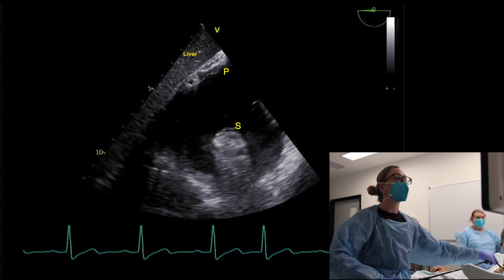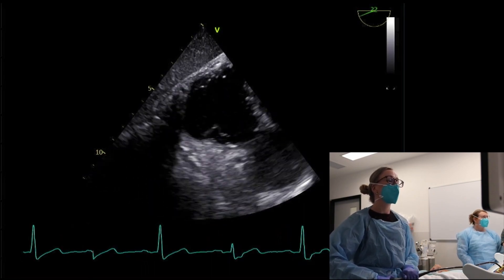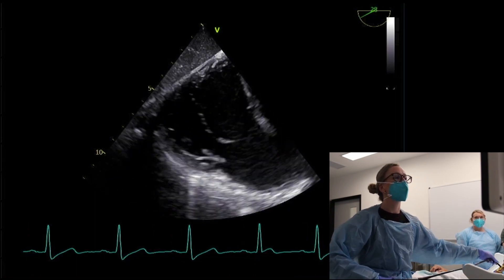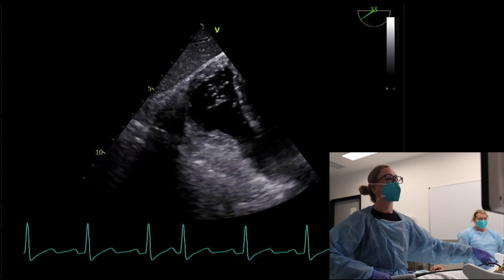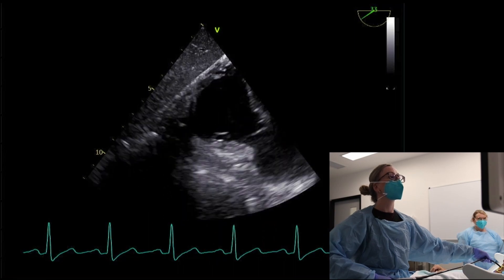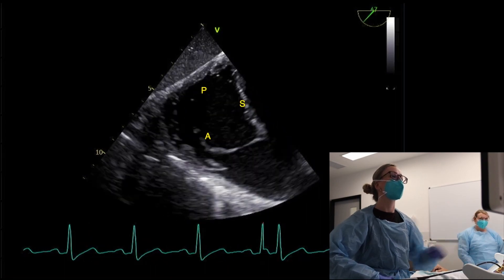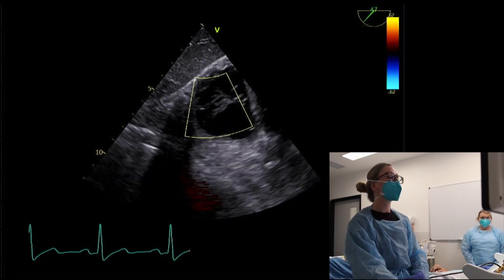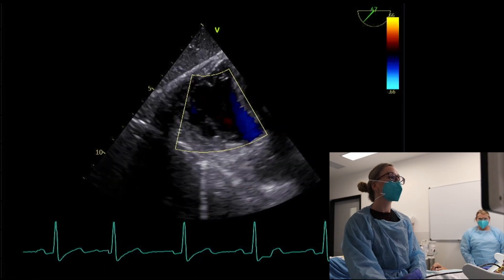We're seeing the septal and probably posterior leaflets of the tricuspid valve. Coming around to 30 to 40 degrees on the omniplane — while slightly rotating to the patient's right — gives the en-face or surgeon's view of the tricuspid valve, where you can see all the leaflets coming together. Popping some color on confirms there's no significant tricuspid regurgitation, consistent with the other views.